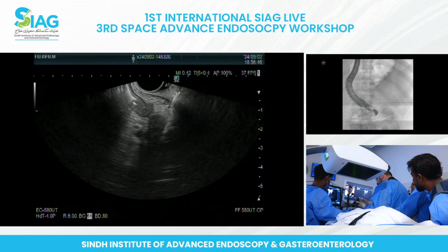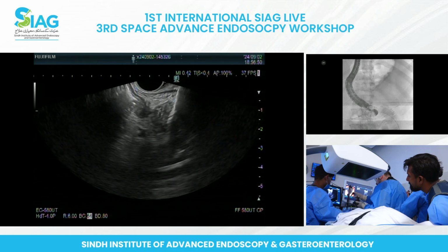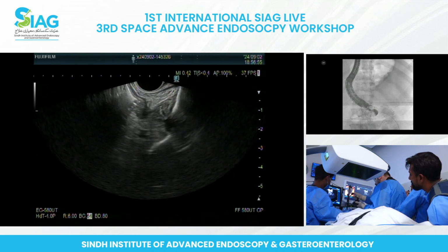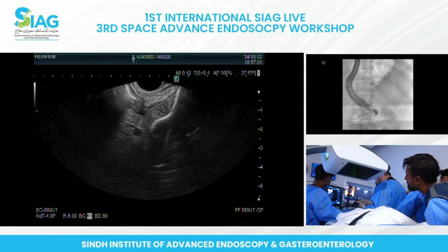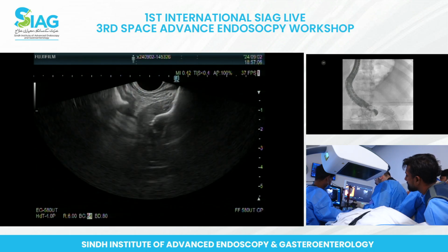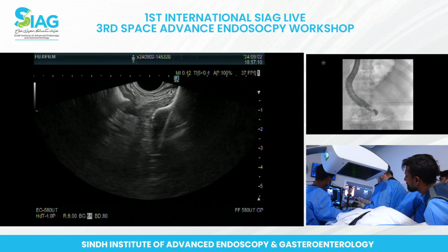So this time he's not going to spend too much time opening the inner dumbbell, because what happens if you take too much time is the small intestine runs away from you. So he opened that quickly and is pulling back so it's into the bowel. Yes, we can see that nicely. Now you can take your time.